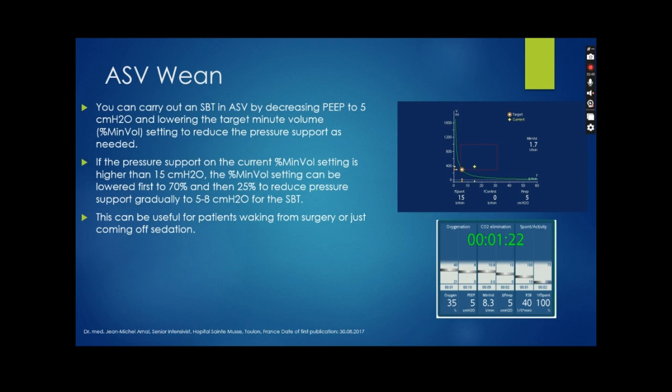I've used this mode very successfully in a lot of our open heart surgery patients as they're waking up from anesthesia. It wakes them up a little bit gently, so they're beginning to have more and more control over their ventilation, as opposed to waking up on a mode such as PRVC and fighting with the ventilator. So it's a gentle way to transition into an SBT for that particular patient population.